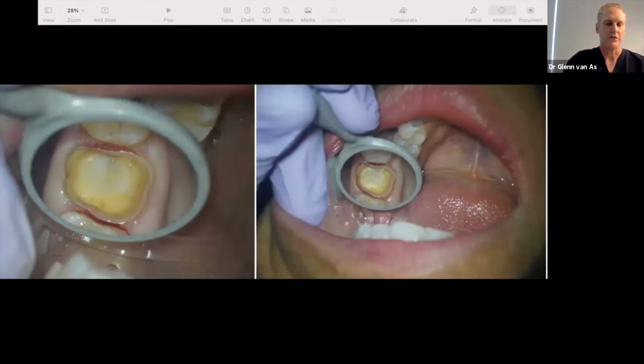And I always hated using cord. I'm just not fond of cord. I still use it occasionally if a patient is very picky, but I try as much as possible to use the laser. What I find is with cord, as soon as the first impression came out, if I took the cord out and the first impression wasn't good, the second impression was even worse because the tissue was slumping back on your margin.